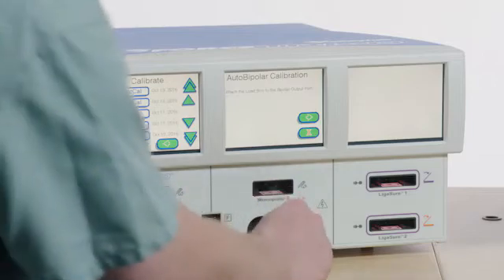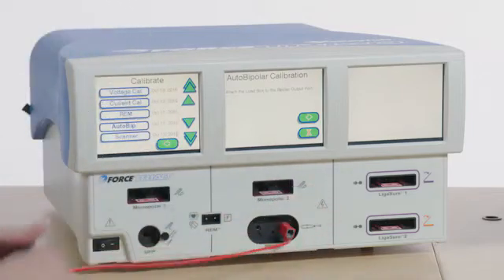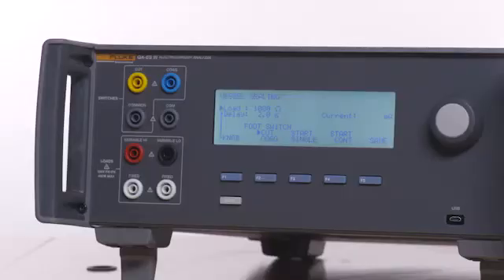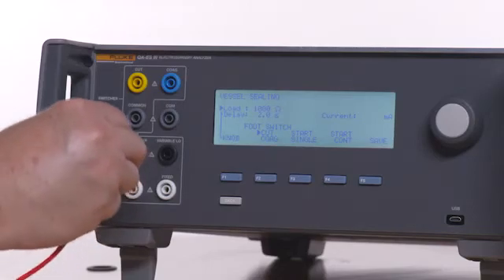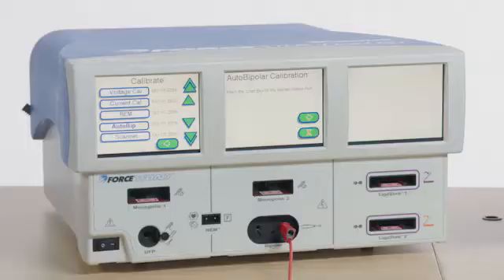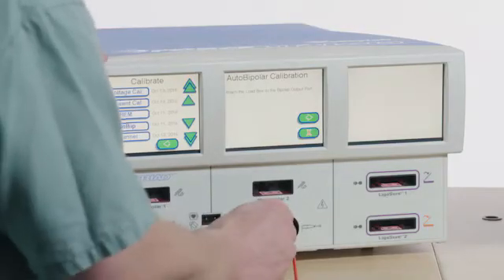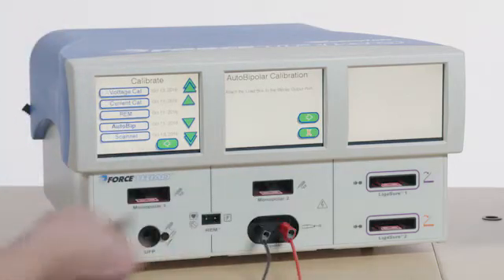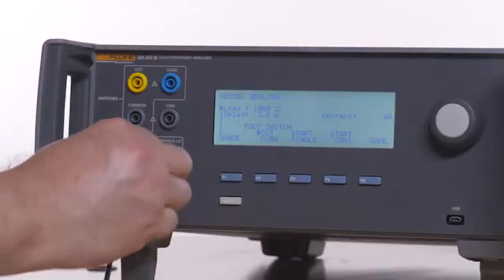Connect a red test lead from either input jack of the Force Triad bipolar port to the variable High on the QAES-3. Connect a black test lead from the other bipolar input jack on the Force Triad to the variable Low on the QAES-3.